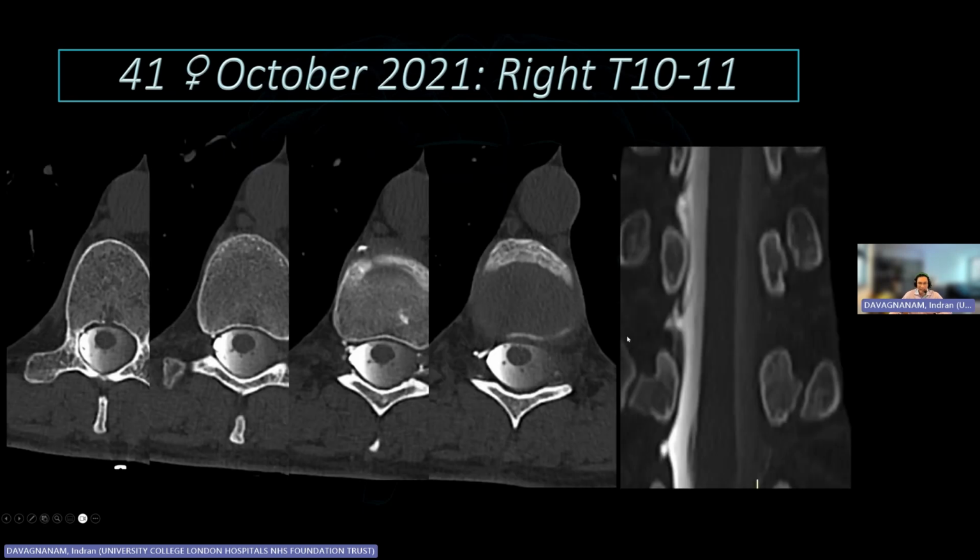And then when we looked at the right side one level down, we could see this funny opacification of a vessel that was just in front of the thecal sac. And if you followed that vessel, you could see it was leading to this slightly complex meningeal diverticulum. So another meningeal diverticulum here, and then filling of some vessels on either side of it.